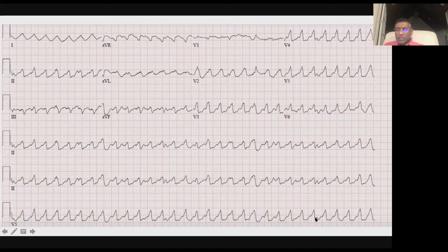And if you start seeing P waves that appear at some times and don't appear at other points in the tracing where it should be, if this is a bump in the ST segment, then you should see it consistently on every ST segment, but you don't. So this is a good candidate for a P wave. And if this is a candidate for a P wave, and there's no P waves here and another P wave over here, what does that make this rhythm? SVT or VT?